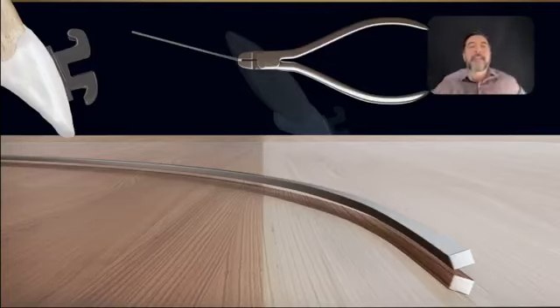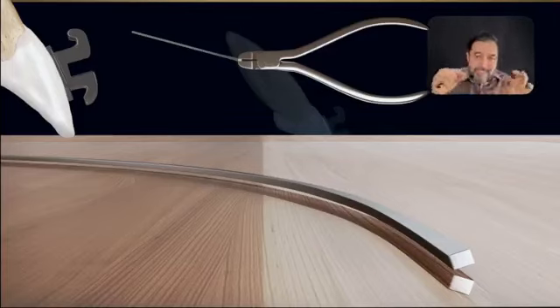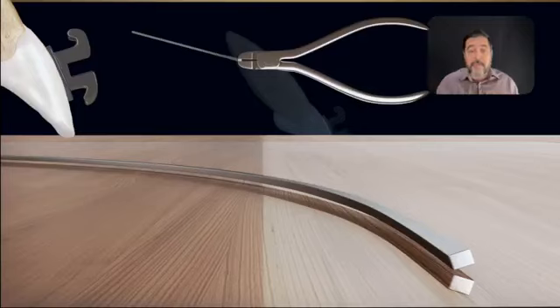The way to do that is, since the application of the bracket, since the first insertion of the bracket, I'm applying the right concept for that. If I'm doing just at the ending of my treatment more proclination of upper, more inclination of upper or lower, I need to understand the concept of the real and relative torque. And I need to balance the real and relative torque in order to have the right inclination.